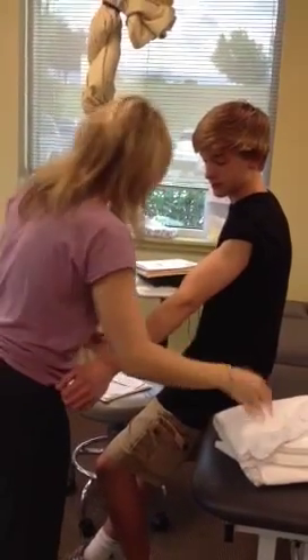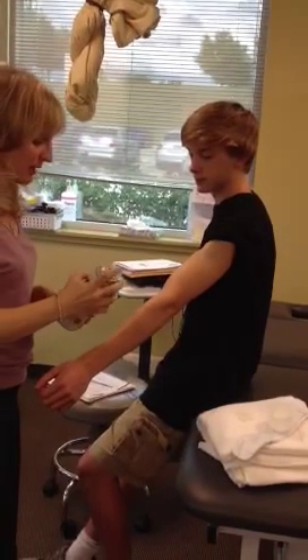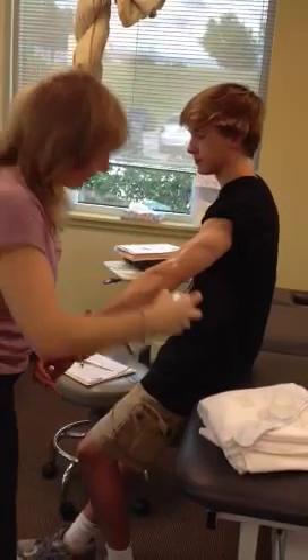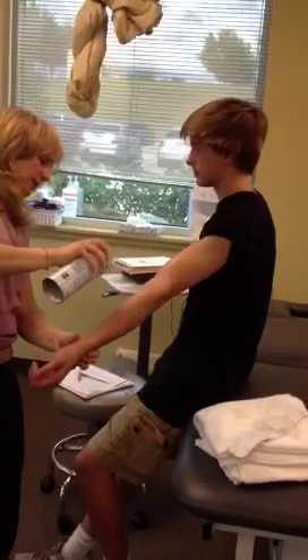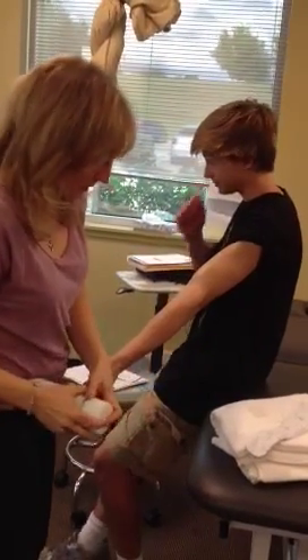And because he sweats and he's an athlete, and I want it to stay a little bit longer, I'm going to spray a little adhesive — but you don't have to necessarily spray adhesive. You can get the adhesive at Academy, any of the soccer stores in town, or even Walmart and Academy too.